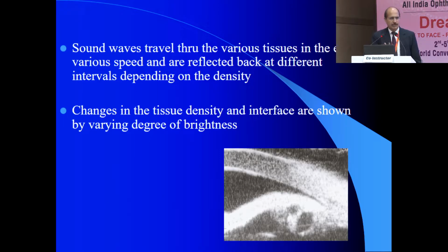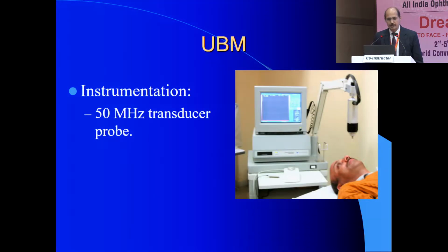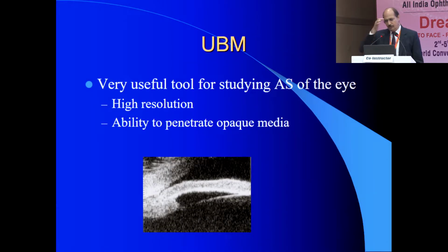So this is typically like any other ultrasound scan basically, because with the high frequency transducer it produces high resolution images, and of course the depth of penetration, as I said, could be a limitation. There are a number of machines now available. This machine is no more available now actually, but in our institution some of the best ultrasound images that we have captured were using this machine, but now it is not there.